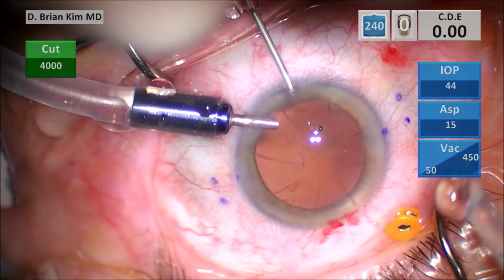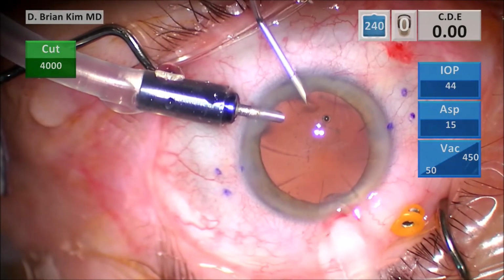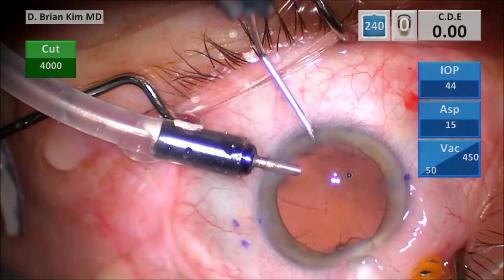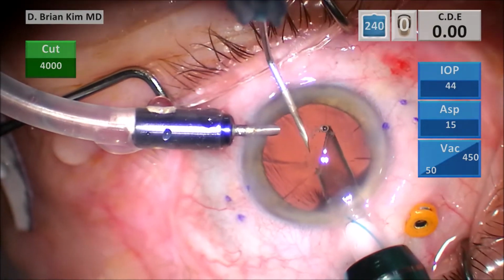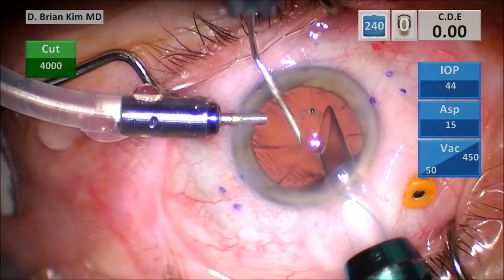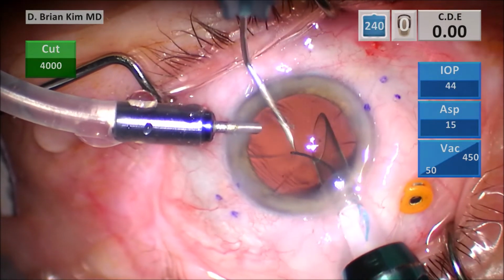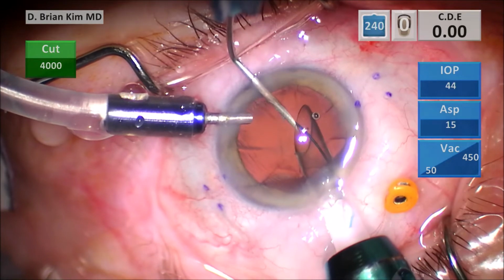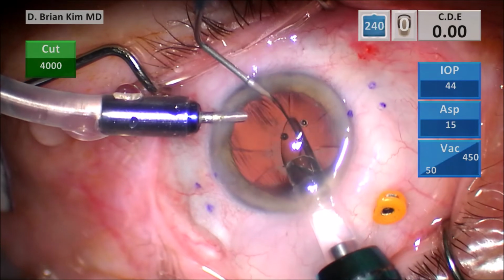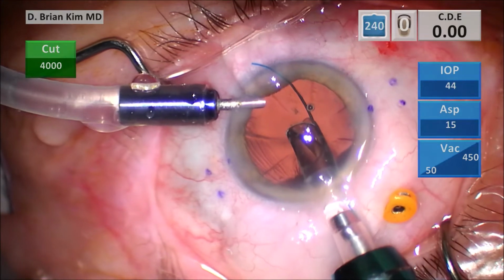So I'll go ahead and place the 25 gauge needle that's bent facing to the right. Again, that's the blue hub needle here. Going through the contralateral incision, placing the injector bevel down, turning the bevel to the left, having my assistant advance the lens. And as she does this, the leading haptic comes out. I make sure I align the haptic to the needle, docking the haptic on the bevel of the needle. And as I align it and she advances the lens, the haptic goes into the needle very nicely. And as I withdraw the needle out, the haptic comes out as well.